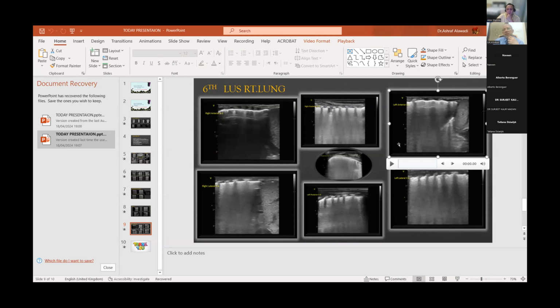This is also this one. And the hemoglobin after blood transfusion was 16, and today is 16. Maybe I'll try weaning from the high frequency because the X-ray shows 9 to 10 ribs today. I decrease the MAP again, I'll try to reach 12. But after that, I will connect to conventional again. Lovely. That's it for today.